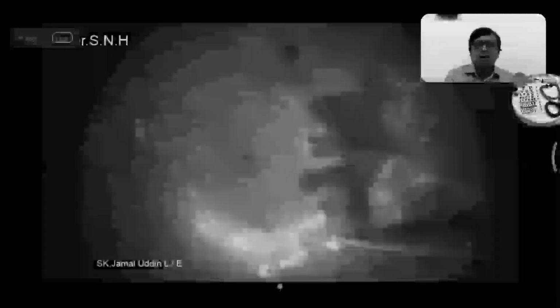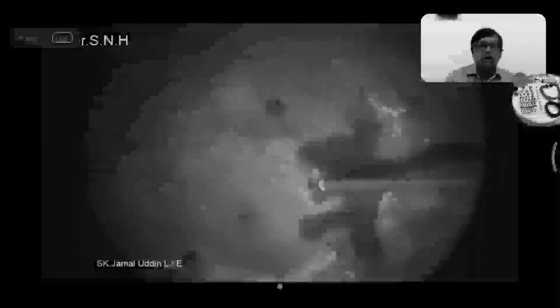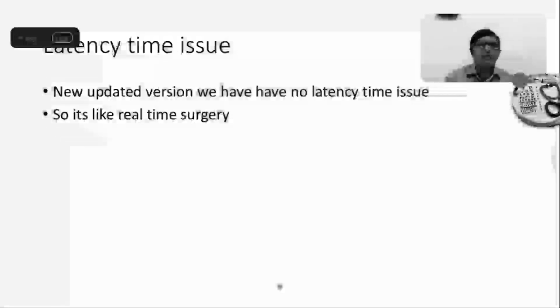I'm more comfortable, and my hands are less shaky when I'm doing this 3D maneuver because it's much better for me. You can see how nicely I can see all this, and I can actually do this because when the view is bigger and magnified, everything is better.